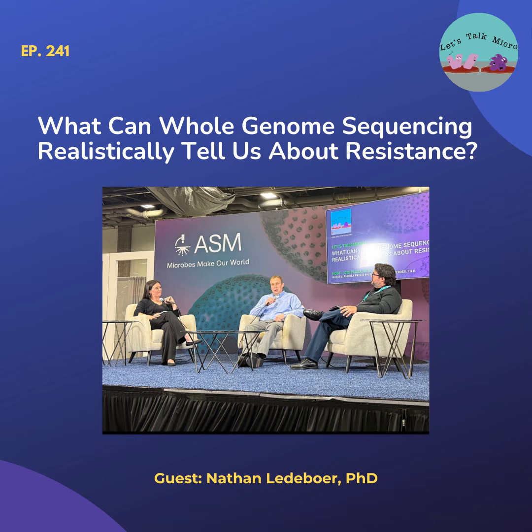The other thing I think that we're really going to have to deal with is today when we have a mixed culture, we just look for different morphologies, right? We pick those different morphologies out of the culture. Well, when you're doing sequencing, you'll get different identifications, but then how do we associate that point mutation? How do we associate that beta-lactamase with an individual organism so that we can use that to help direct treatment?